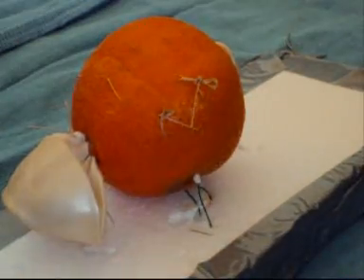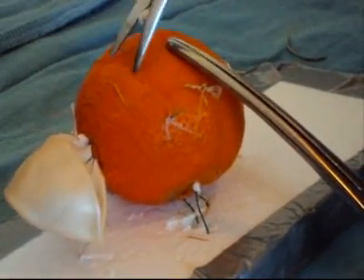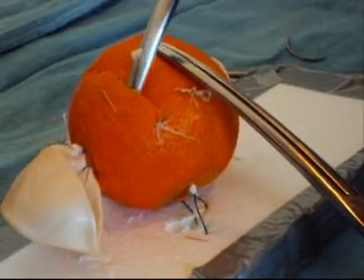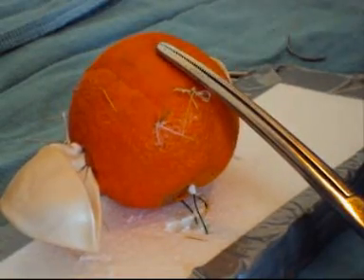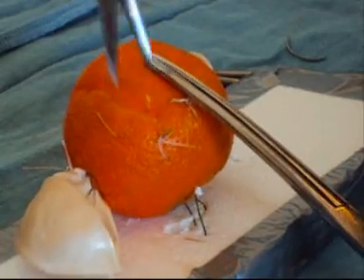Once we make an incision inside the prostate as done here, we can then incise the adhesions and create a plane between the so-called adenoma — or the pulp of the clementine — and the skin, which represents the compressed normal prostate tissue, exactly as we would do in real life. This plane can be extended further around.